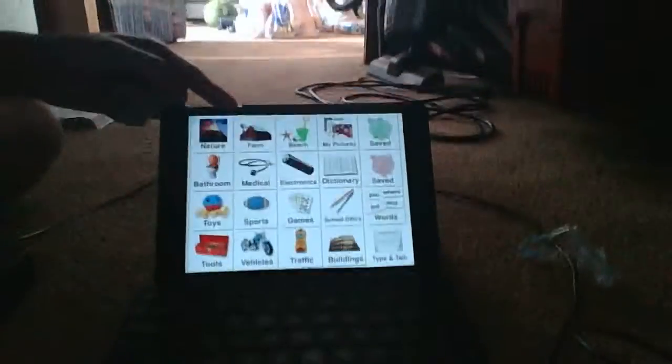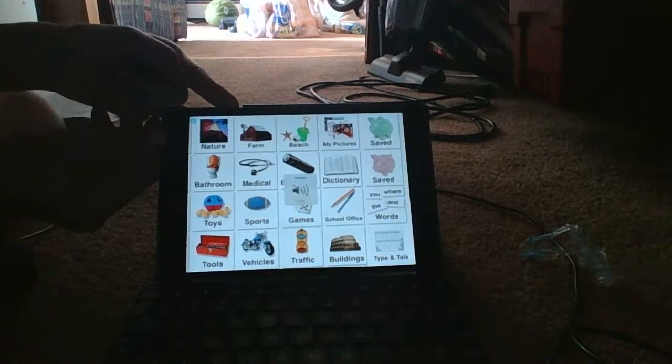So how would I use this if I were Joey and I wasn't allowed to speak in English in the Spanish-speaking classroom? Well, first, I would have to turn off the sound on the iPad, and then that way I would end up, instead of using this as a speech-generating device, as essentially PECs on an iPad, which certainly beats struggling to communicate. So, let's try. Let's turn off the sound. The sound is over here. Oh dear, you can't see that. We turn down the sound, volume is off.